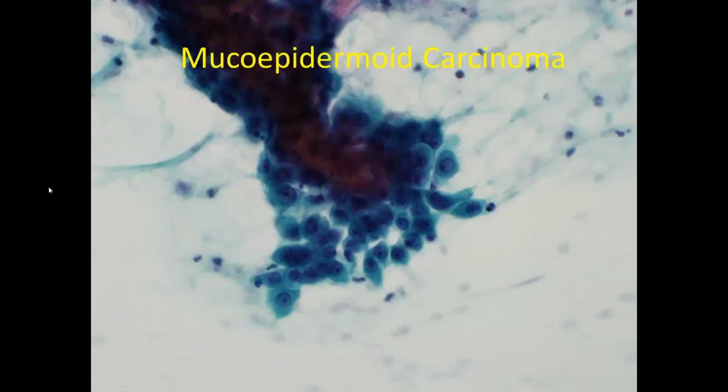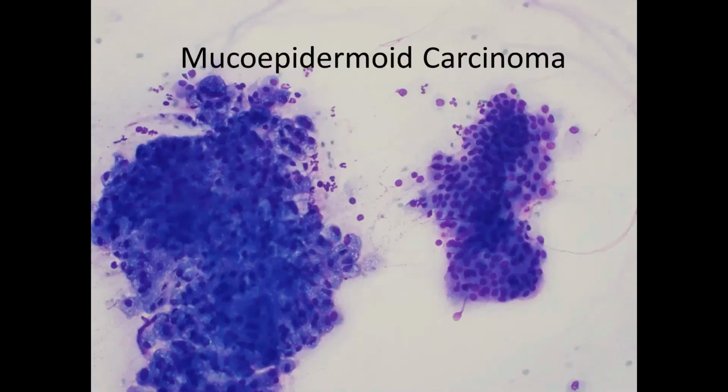In the pap you can appreciate relatively bland nuclei as well as this angulated, relatively dense cytoplasm, and the cells are forming these groups. Again, you typically have two cell types in a mucoepidermoid carcinoma. We can always talk about the third cell type, intermediate cells, but I think those are more theoretical and not something you actually see in either surgical pathology or cytopathology. We have our dense angulated squamoid cells, and we have our histiocyte-like cells, which are the mucin-producing cells and the diagnostic cells of these mucoepidermoid carcinomas.